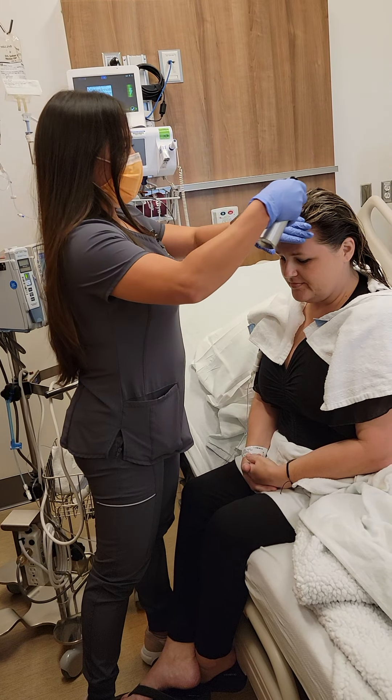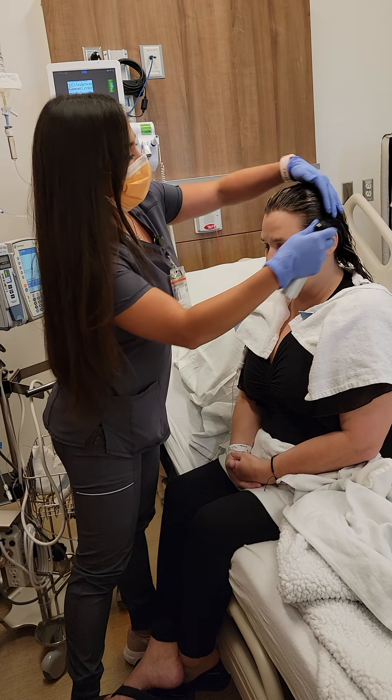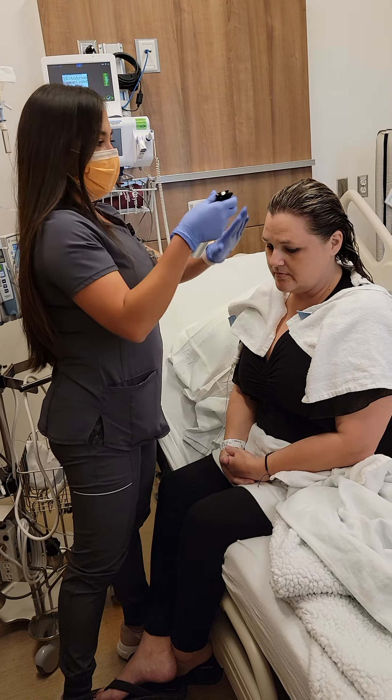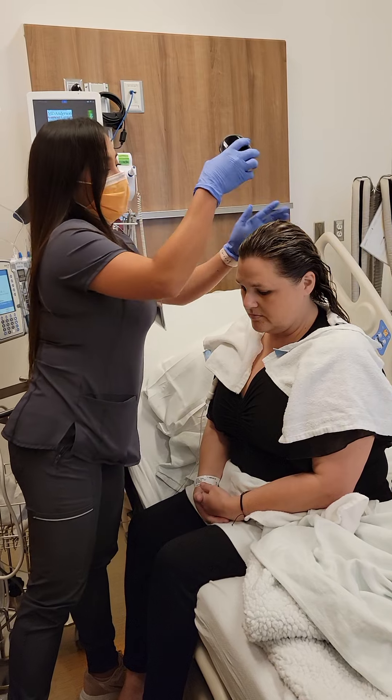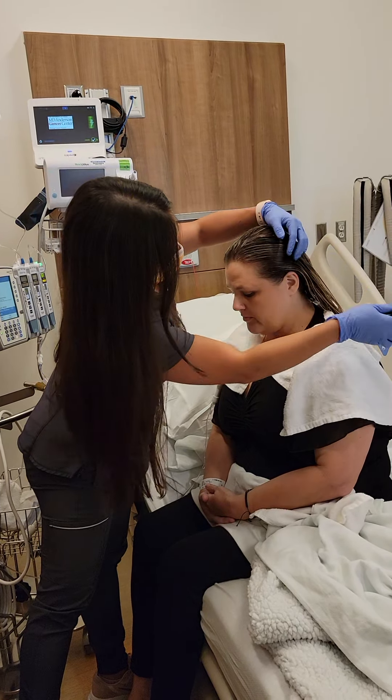So she already wet her hair. I like to do it sleek back. Some patients, they like to part it at the middle. But like I usually tell my patients, go in the restroom and wet your hair in the sink — it's better. You can actually get the hair wet, then just do it sleek back and comb it through because you don't want it all tangled up afterwards. So it looks good now.